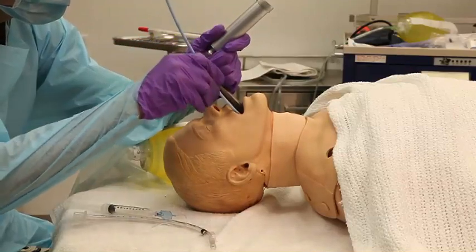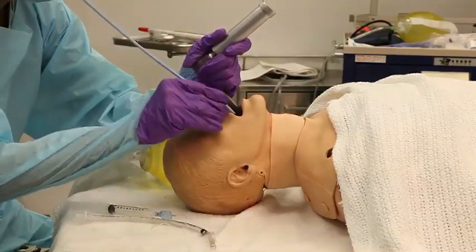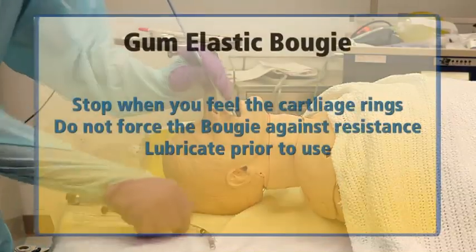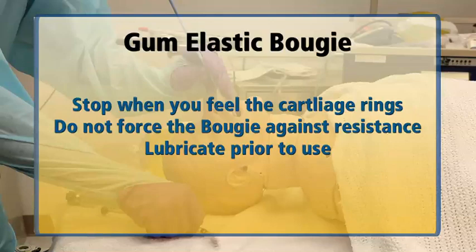Slide the bougie in towards the cords until you feel the tip contact the cartilage rings, identified by the series of clicks or bumps. Stop advancing at this point. Do not force the bougie against resistance at any time. Remember to lubricate the bougie prior to using.